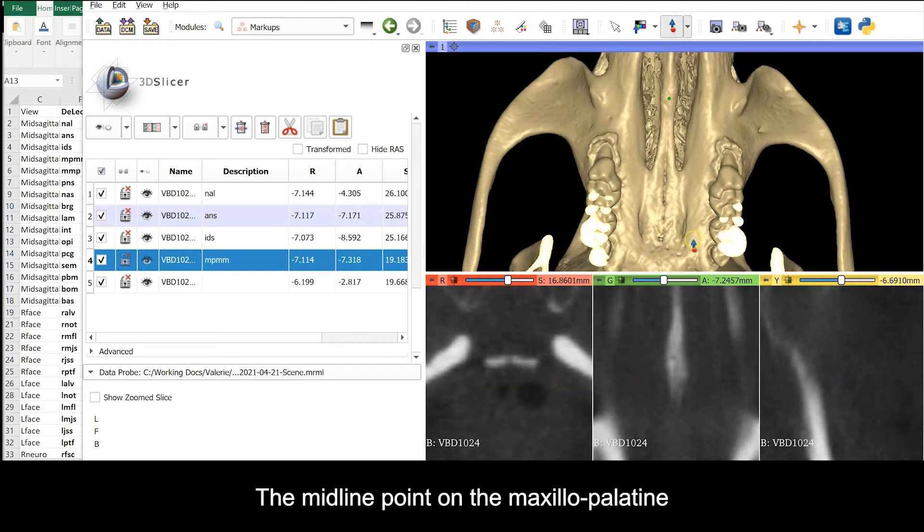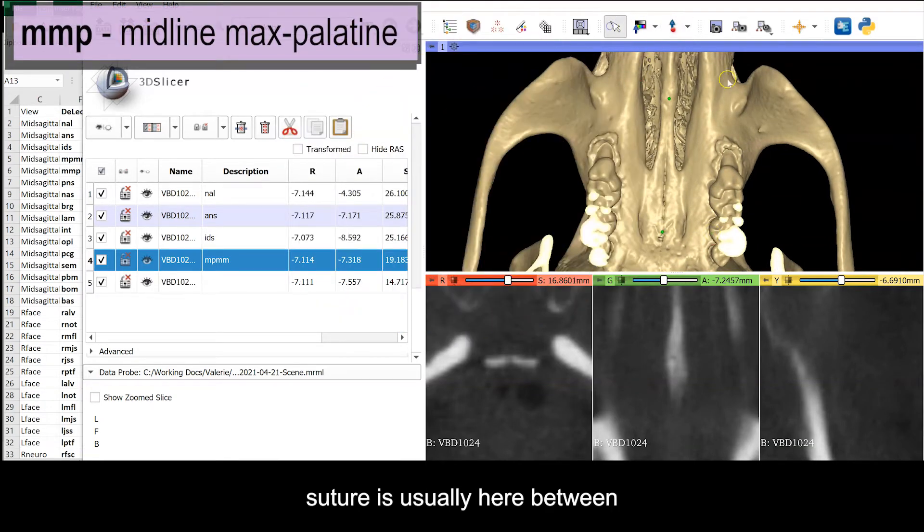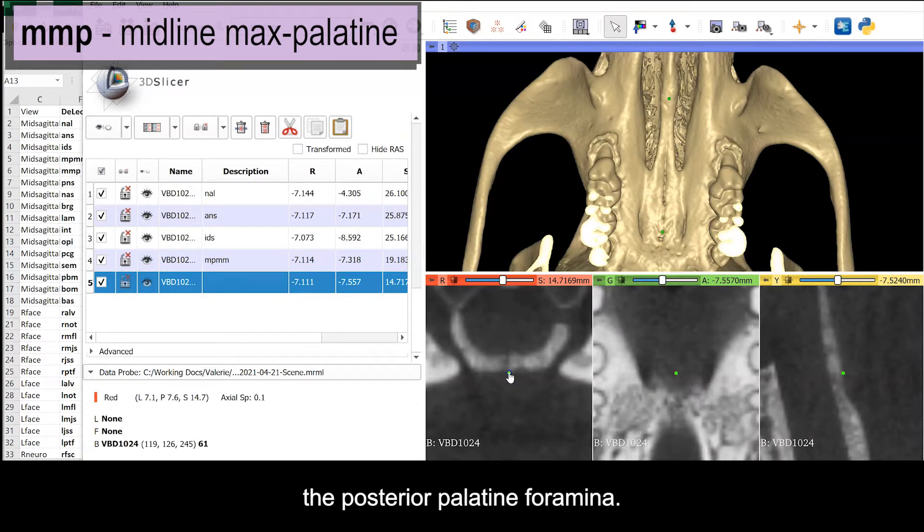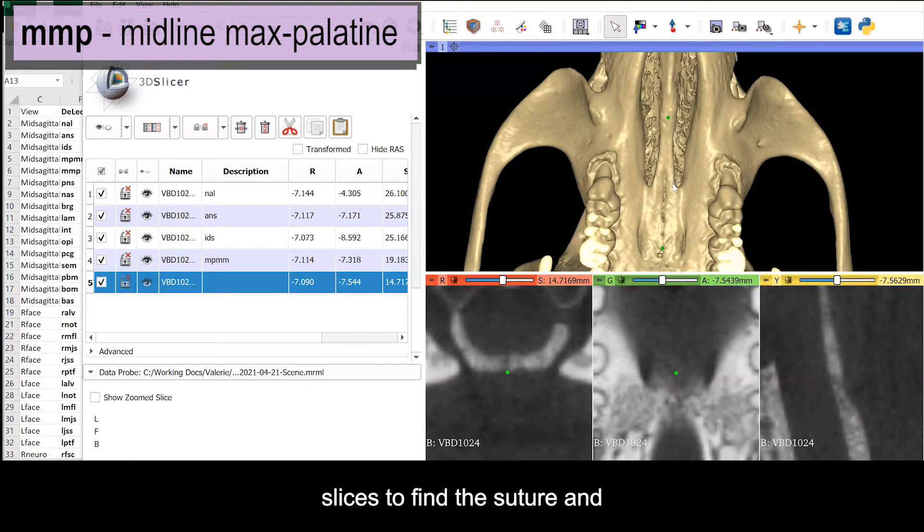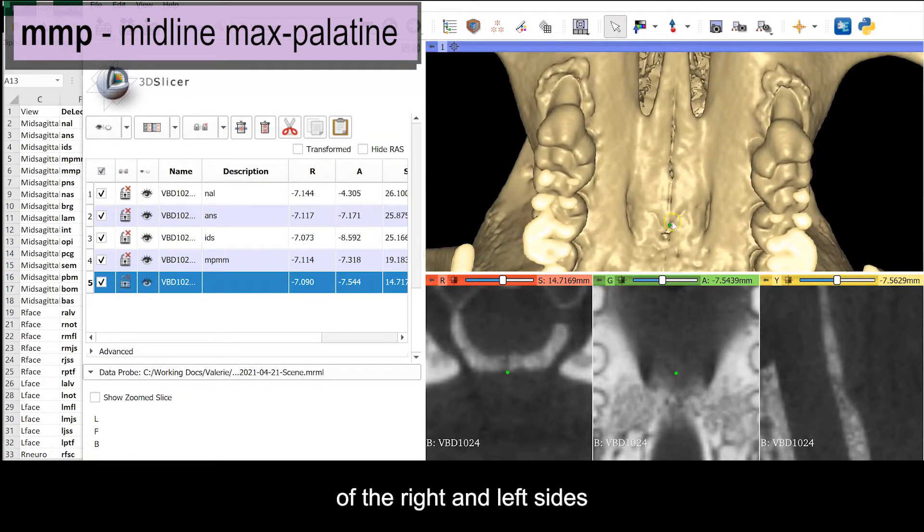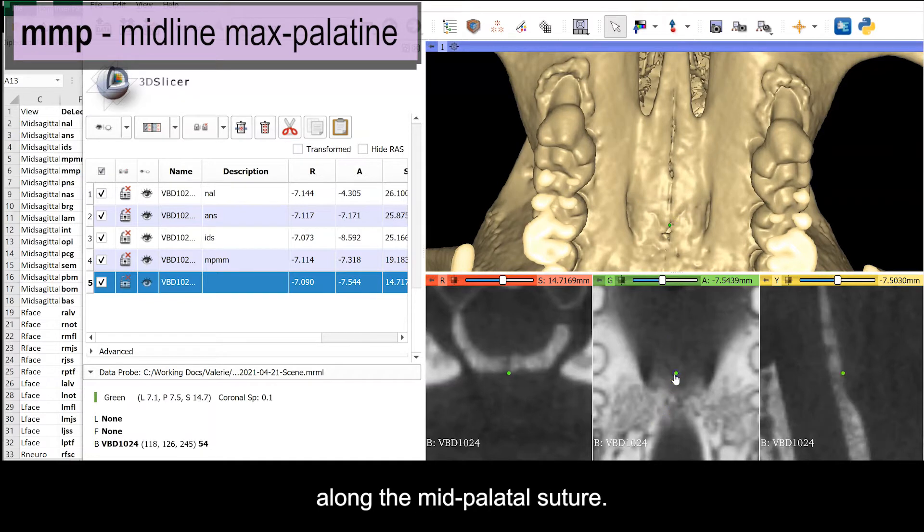The midline point on the maxillopalatine suture is usually here between the palatine foramina. There's often asymmetry at this point as well, so scroll through the transverse slices to find the suture and place the point at the average of the right and left sides along the mid-palatal suture.